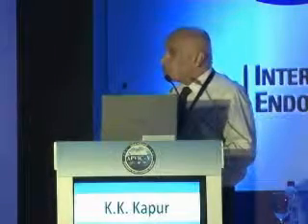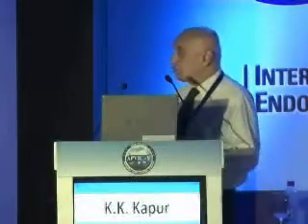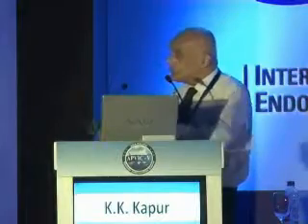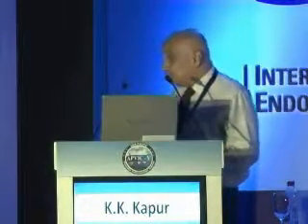And sometimes it's a partial clot. So you are seeing some flow, you are seeing some augmentation, then you tend to miss it. Segmental calf vein thrombosis, that is, it's not present throughout the longitudinal extent of the calf veins. Then also you will only see part of the veins which are patent and try to extrapolate that the entire venous system of the calf is okay. And similarly, you can get segmental iliac vein blocks. And of course, if the patient is asymptomatic, generally the Doppler tends to be less accurate, possibly because of a less meticulous examination performed at that time.